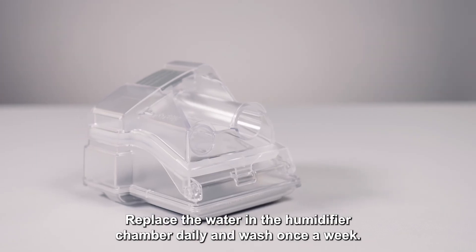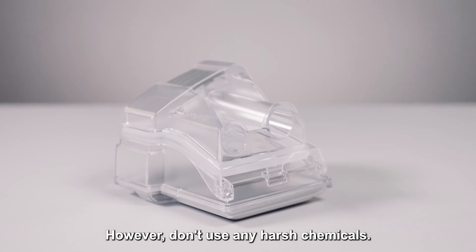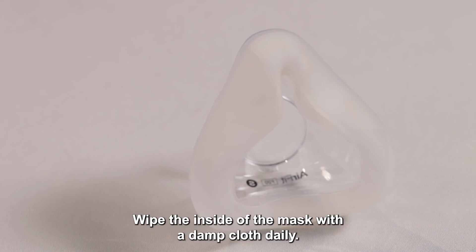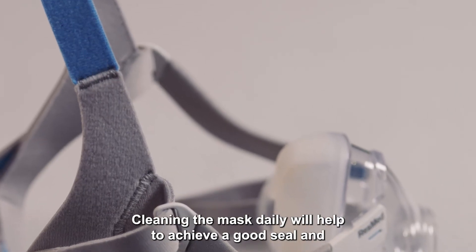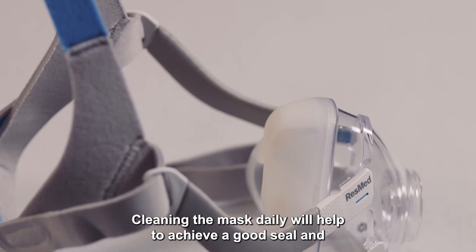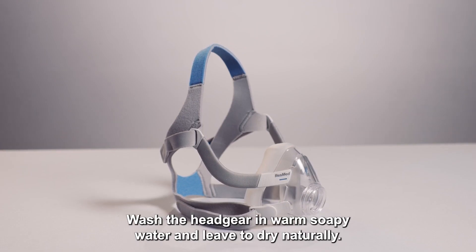Replace the water in the humidifier chamber daily and wash it once a week; however, do not use any harsh chemicals. Wipe the inside of the mask with a damp cloth daily. Do not use baby wipes as this can damage the seal. Cleaning the mask daily will help to achieve a good seal and prevent the mask moving around. Wash the headgear in warm soapy water and leave to dry naturally.